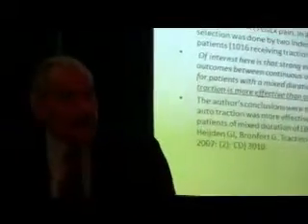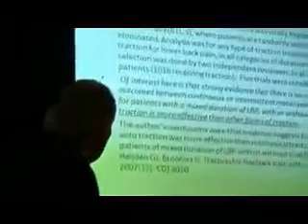And if you get results on the device that you use, you're always going to have patients who'll be able to pay for the device. And you'll have new patients. If this many patient population of all these traction devices on randomized control does not work, there's something wrong. And I think it has to do with linear versus three-dimensional. That's my opinion. Lack of movement when you're doing the manipulation, traction manipulation. So let's go on to the next slide.